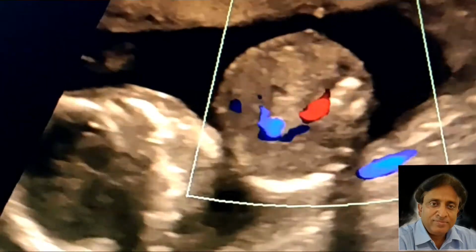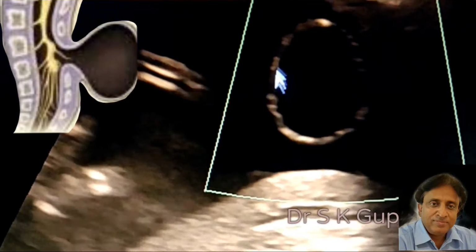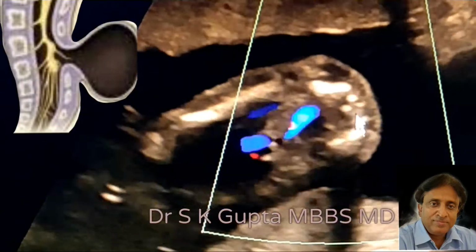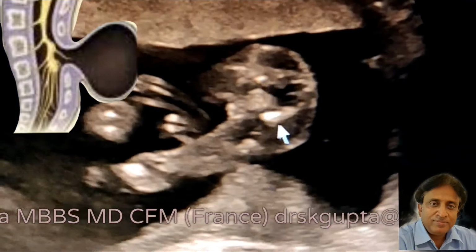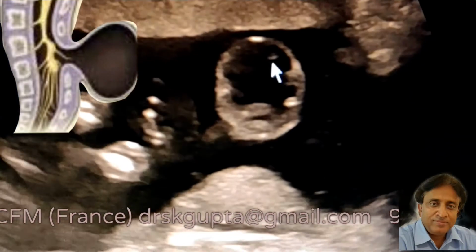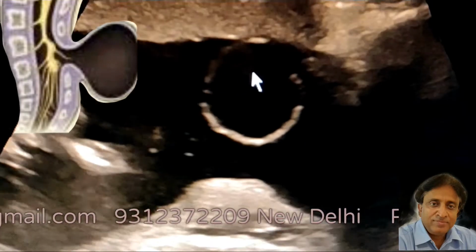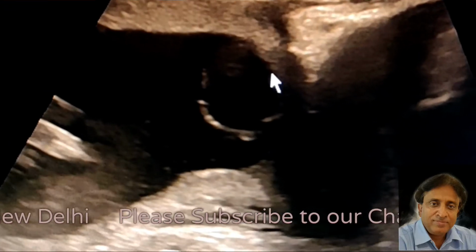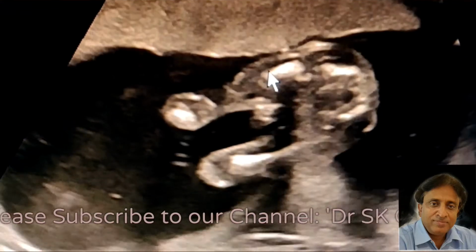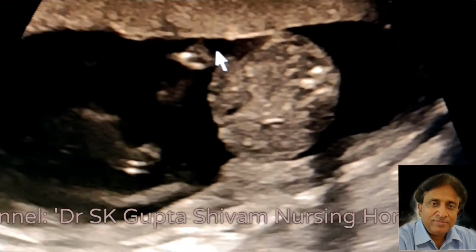You can see that this is the femur bone and there is a cystic swelling at just the level of the sacrococcyx. On the left side there is a cystic swelling. This is nothing but the meningocoel, which is more towards the left hand side, though it is in the midline in the coccygeal region, and you will see again that it appears more on the left hand side.